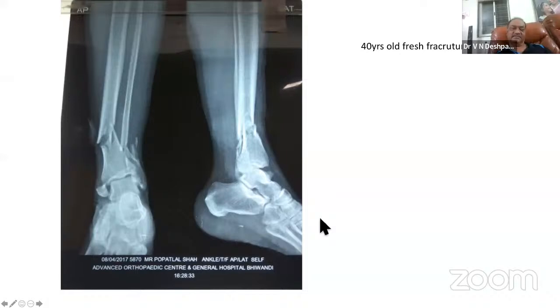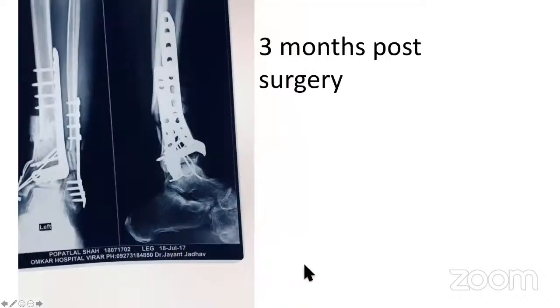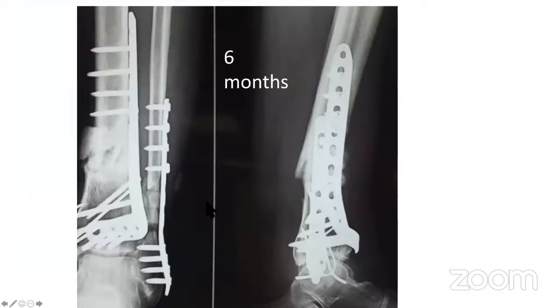This was a fracture of the lower end of the tibia, and this was the first operation. Anything you can find which is not right, 3 months now? Probably this angulation. So this has not been reduced properly. Otherwise, this was a badly comminuted fibula which he plated, and he has done the tension band for the medial malleolus. Now 3 months and 6 months. Patient has a pain. Any comment? The fracture has not healed and there is an angulation, but there is a doubtful union and therefore there is a pain.